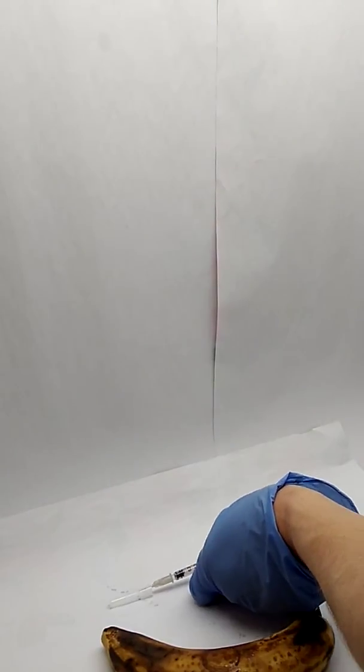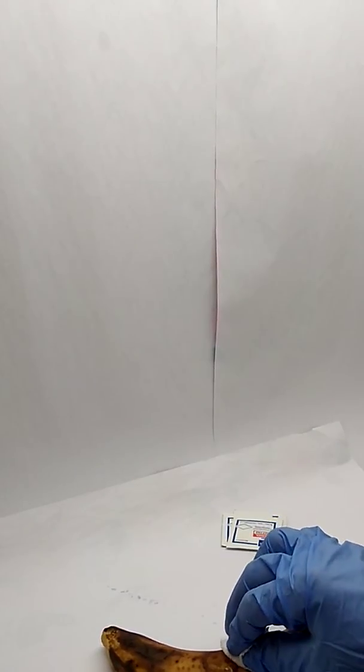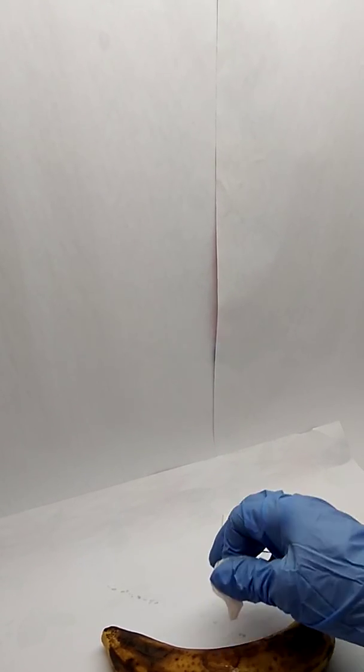Now I'm going to take my new gauze pad, I'm going to scoop cap my needle, go straight into the sharps container, which is right next to me. Take a new gauze pad, I'm going to blot that injection site and hold that on, making sure that I'm not rubbing or massaging. Now I'm going to document in the MAR that I've administered the heparin medication as specified. And that now is the end of my procedure.